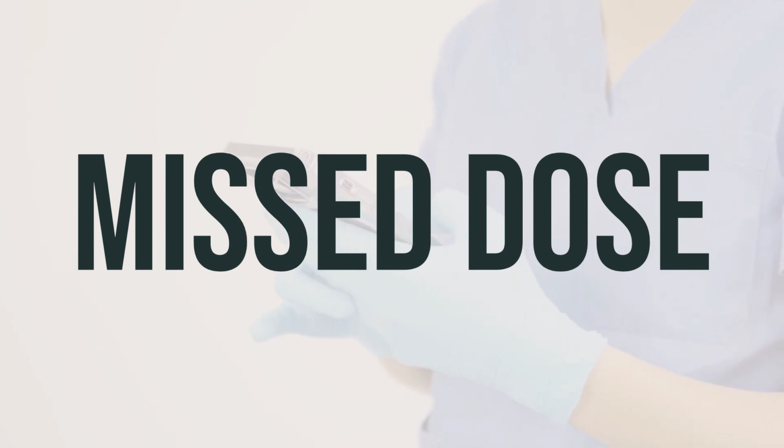One of the main benefits of the Paragard T380A is that it is highly effective at preventing pregnancy, with a success rate of over 99%. It is also reversible, meaning that it can be removed at any time if a woman decides she wants to become pregnant. The Paragard T380A does not require any daily dosage or specific timing for it to be effective. Once it is inserted, it works continuously to prevent pregnancy. However, it is important to have it checked by a healthcare professional regularly to ensure it is still in place and functioning correctly. Overall, the Paragard T380A is a safe and effective form of birth control for women who are looking for a long-term, non-hormonal option.